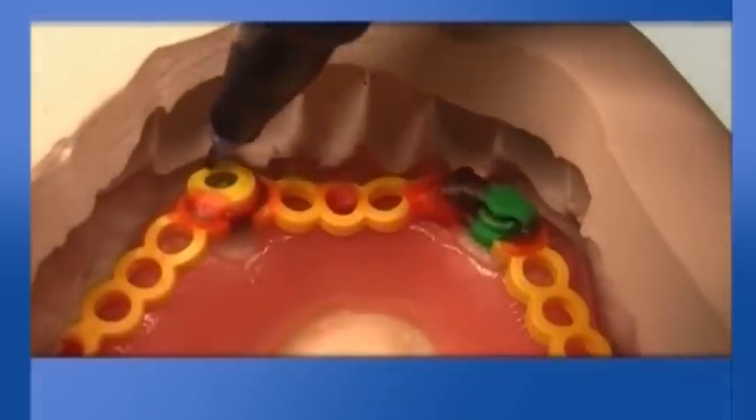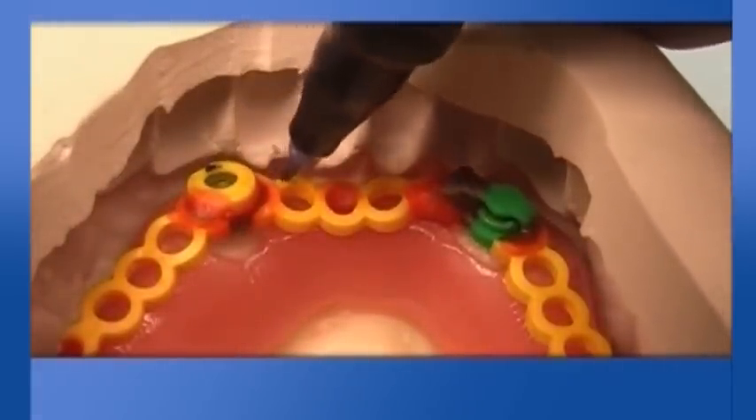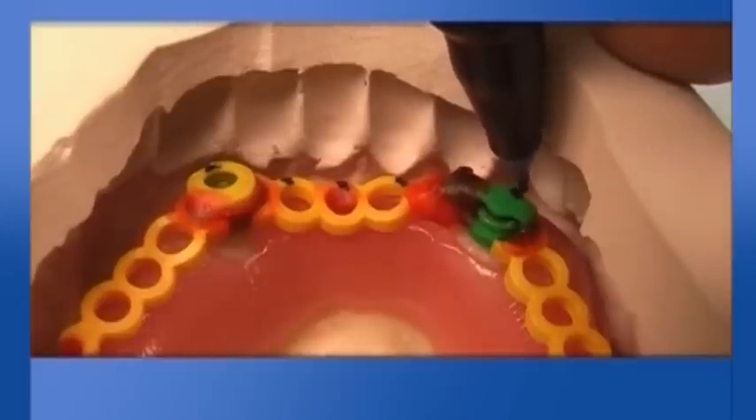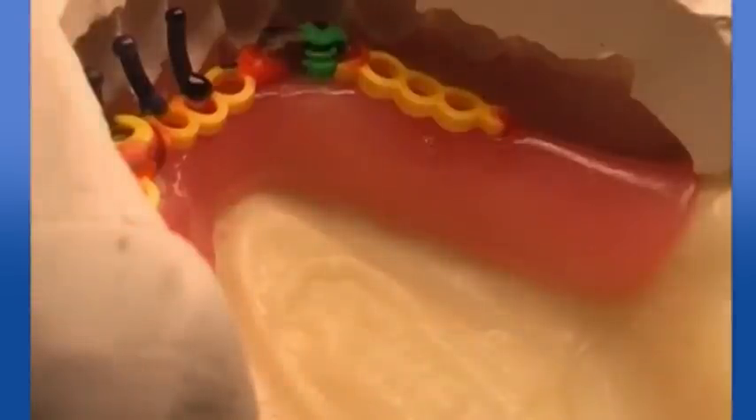Working on the master model, the trial mask always goes in position, allowing placement of reinforcement pins for the teeth. This reinforcement will strengthen the denture, avoiding tooth break.